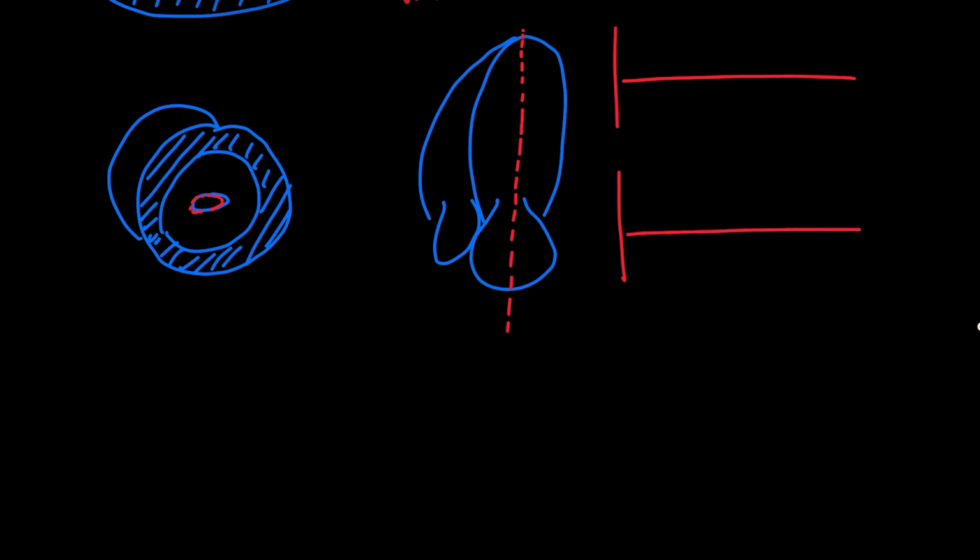So normally, during diastole, you'll see early inflow, and then you'll see some late inflow, the E wave and A wave. And then in systole, you won't see anything. And then again, in diastole, you'll see an E wave, A wave, something like that. What will you see with a stiff valve? Well, instead of a nicely defined E and A wave, you'll see something like this.